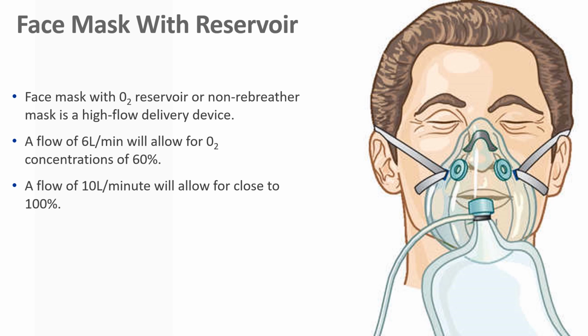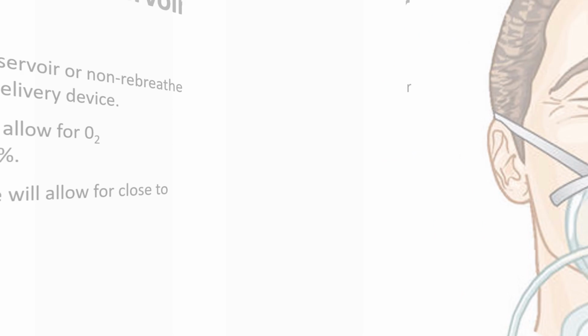Most of the time, you do fine with the nasal cannula on 2 liters. They do great. However, we'll talk about that later.